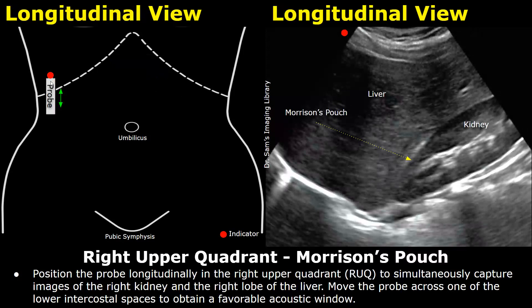Next, position the probe longitudinally in the right upper quadrant to capture images of the right kidney and the right lobe of the liver. This is a longitudinal plane, so the indicator is towards the head of the patient. You can move the probe across one of the lower intercostal spaces to remove rib shadows. The region of interest is Morrison's pouch — the potential space between the right lobe of the liver and the right kidney. The pleural space and diaphragm are also visible, and fluid may be found below the diaphragm or as pleural fluid in case of pleural effusion.